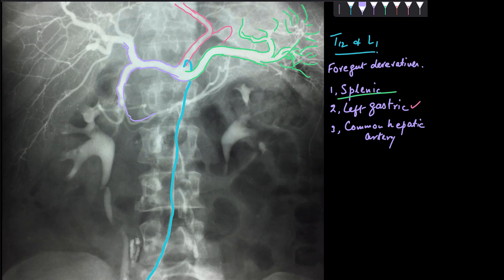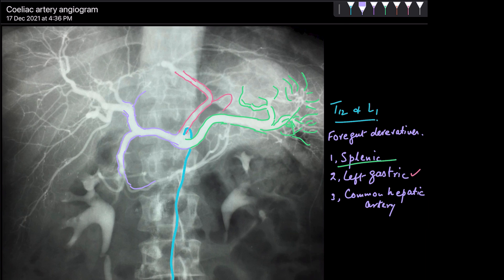The hepatic artery proper ascends up, gives the right gastric artery, and after that it divides into the left and right hepatic arteries. You can see these right and left hepatic arteries branching off — they carry arterial blood to my liver. Around 20 to 25 percent of the blood which reaches the liver is delivered via this hepatic artery proper, and you can see its multiple branches widely distributed within the right and left lobes of the liver.